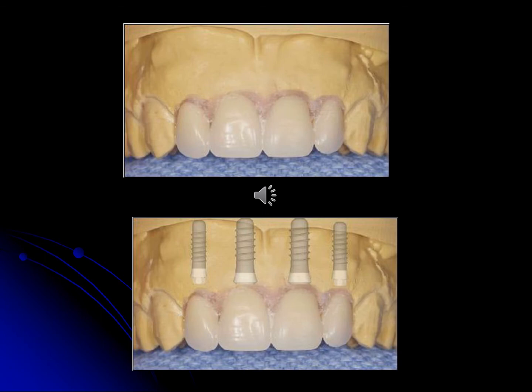If the space between the upper canines is wide, we can use 4 implants to replace the missing teeth. If the space between the two canines is limited, we can use 2 implants to support a fixed prosthesis. If the patient has a financial problem, we can prepare a third option, a fixed partial prosthesis between the canine and the canine. Or the patient can use a removable denture. We don't have only one option, we have multiple options. We should design the prosthesis first, and after that discuss with the patient about our options.